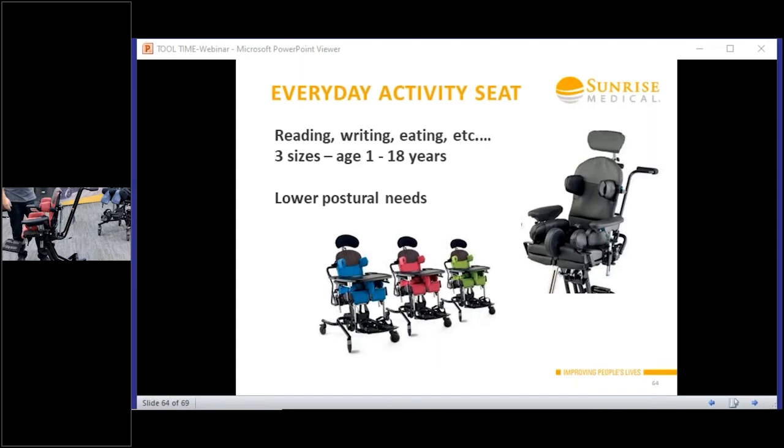Lateral height is Allen keys, the same, very, very similar across the whole range. When you start getting to the laterals, the same laterals are pretty much on all the models. So you've got your 2 Allen keys, it's going to give you your height. Your Allen key, I'll just zoom in so you can all see that. It's going to give you your recline. It's just going to give you these bits of adjustment that you want. It's just going to enable you to get that position that you want when you've worked out what you need to achieve. You can go as complex as you want to, or as stripped back as you want. So it just gives that full range.